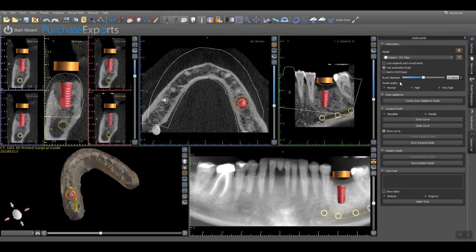The guide quality can also be adjusted with a default setting of Normal, with additional settings of High and Very High as options that will increase internal detail of the surgical guide based on the anatomy of the STL virtual model. Typically, the Normal setting will provide for an unencumbered path of insertion and removal as printed, requiring very little post-printing processing.